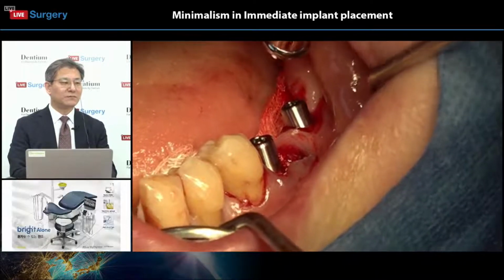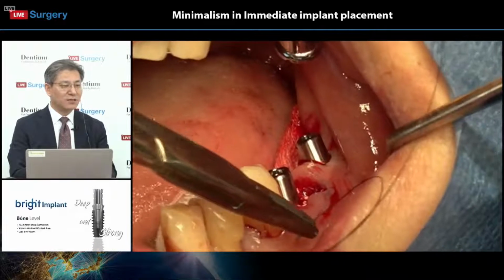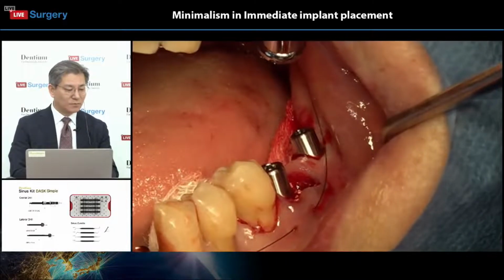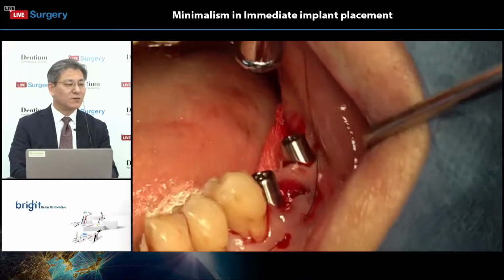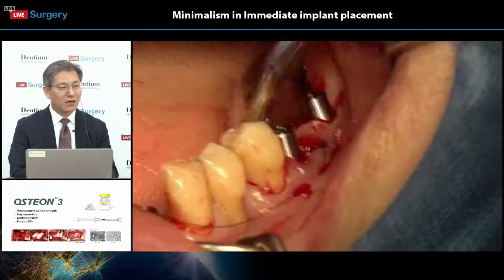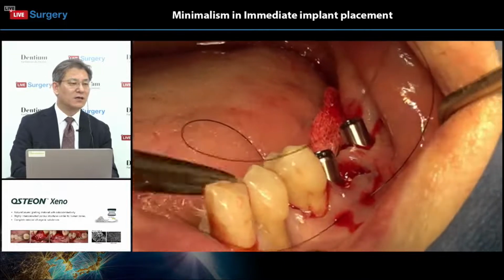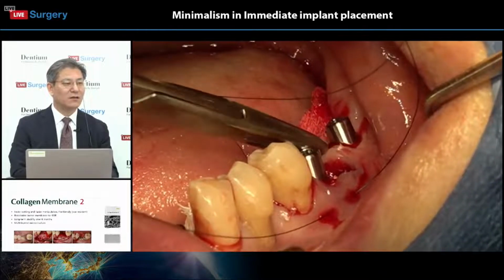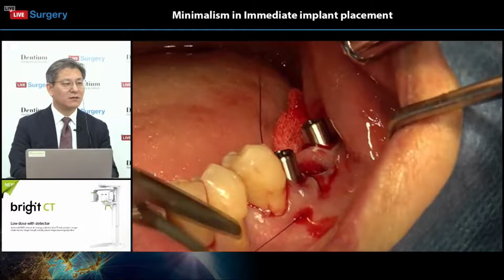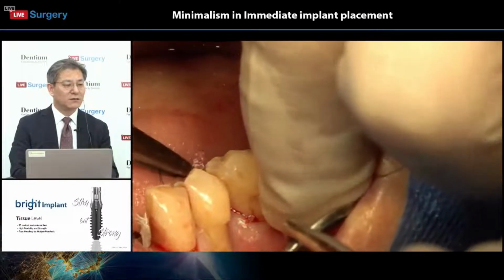Okay. He will do some suture knot here. Yeah. The horizontal mattress sutures will be trying. The lingual side maybe have a little bit modified to making a knot. Okay, so making a knot here. Yeah, it looks good.